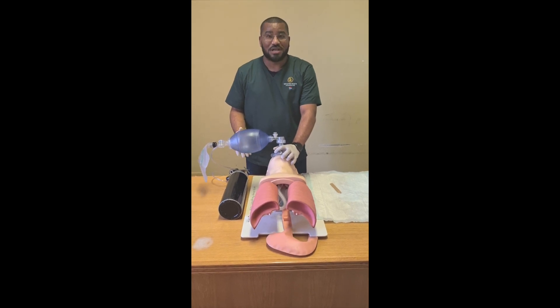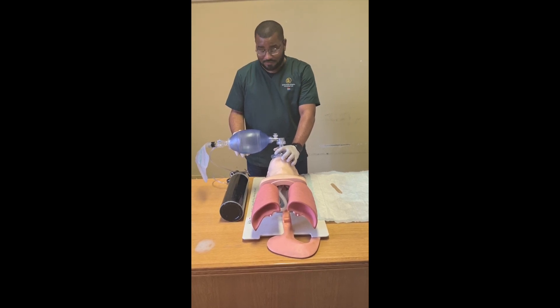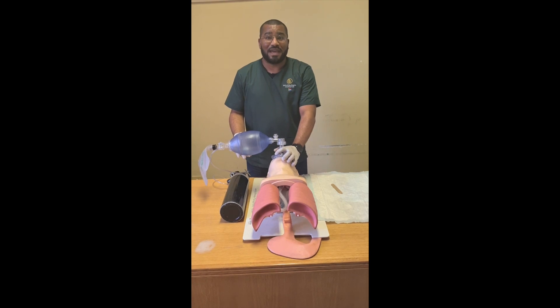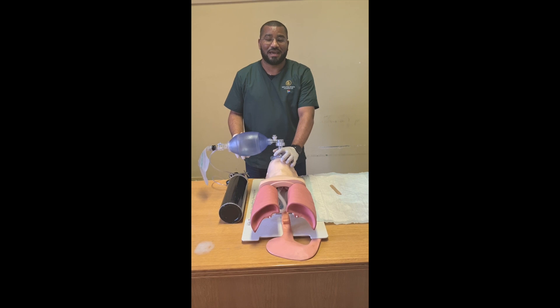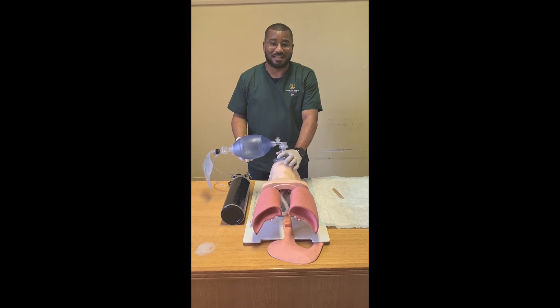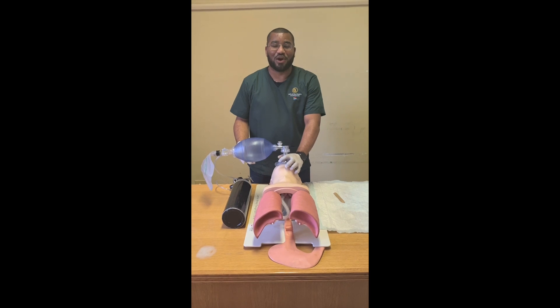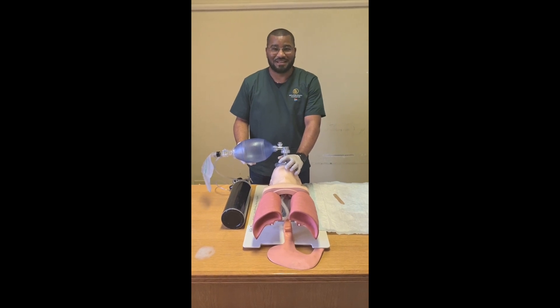There you have it — effective bag and mask ventilation of an unconscious adult patient. For further instruction, please join me in the simulation lab for a practical demonstration and for practicing of this procedure. Until next time, goodbye.